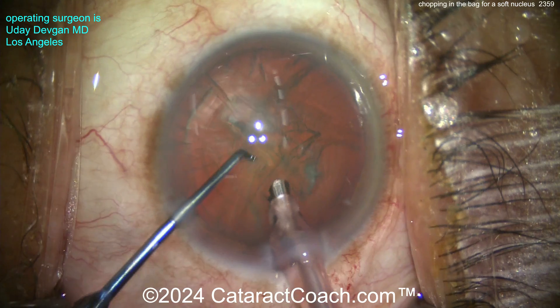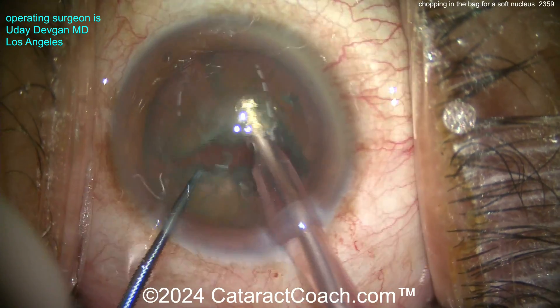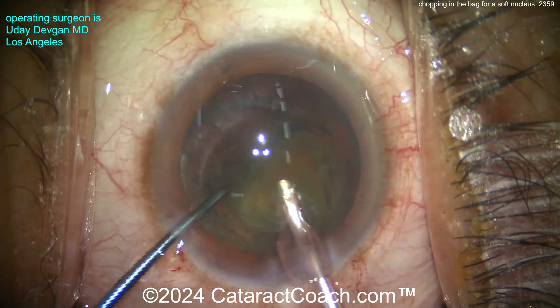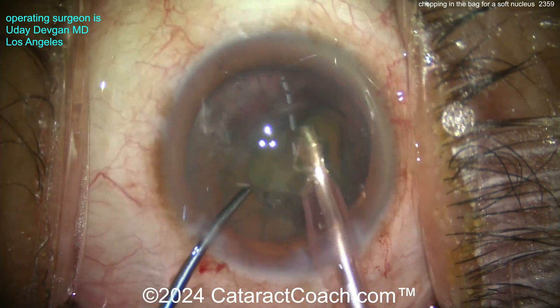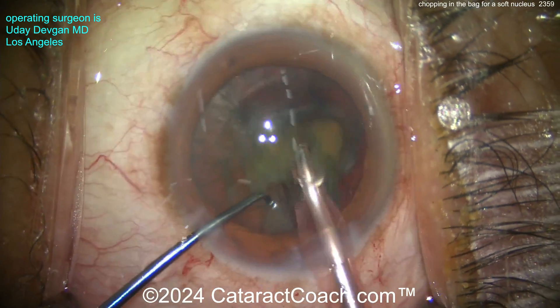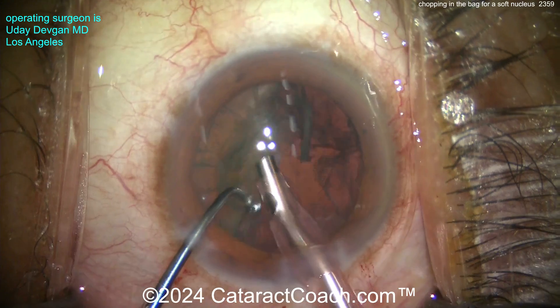Here comes the phaco probe and the chopper. Going with a high vacuum level — buzz the phaco probe into the nucleus. Chopper goes in as well, and there's the chop. Propagate that chop — a little bit of a combo chop, not quite full horizontal or vertical. Now look how you use the chopper to bring one piece of the nucleus out of the bag while the chopper holds the other hemi-nucleus — kind of a way to give more of a gap. Do you need to sub-chop it anymore? Well, not really.